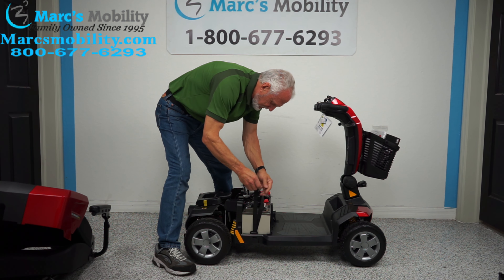So this is how you change the batteries in a Victory LX Sport Mobility Scooter by Pride Mobility.